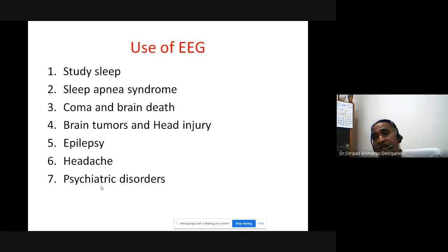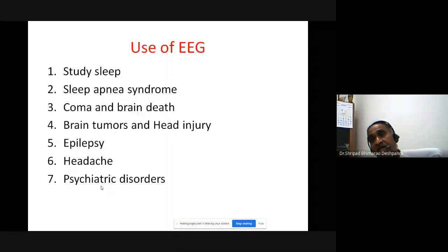Especially if there is a brain death, there is no activity, so no EEG. Or in a coma, you don't have those synchronizations. You may have a wave pattern altogether not matching with anything, or you may not have one. A coma is a condition where the reticular system is damaged, or is not communicating with the cortical system, so that means the synchronization is lost.